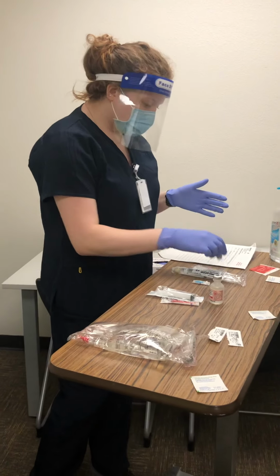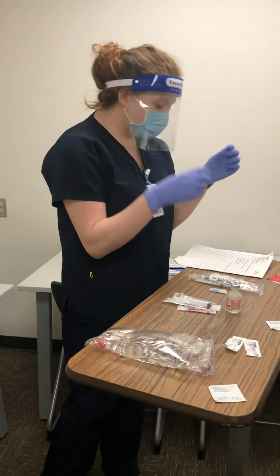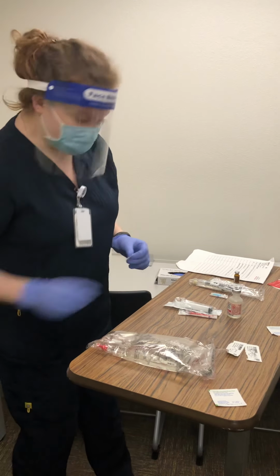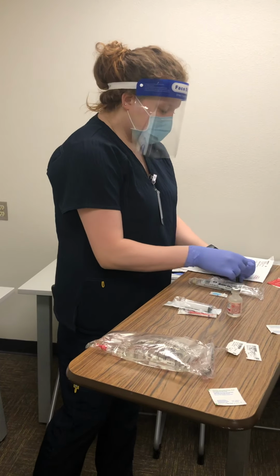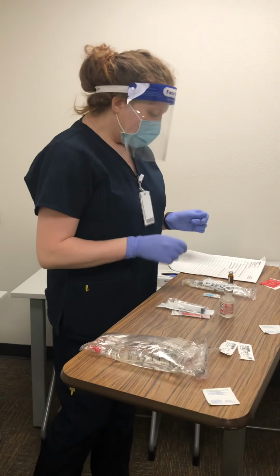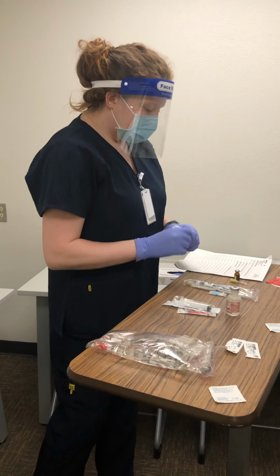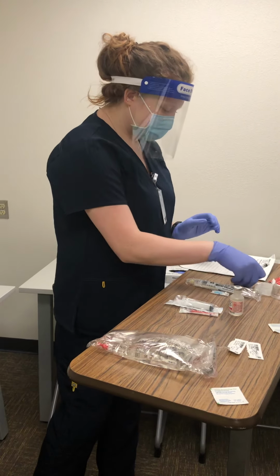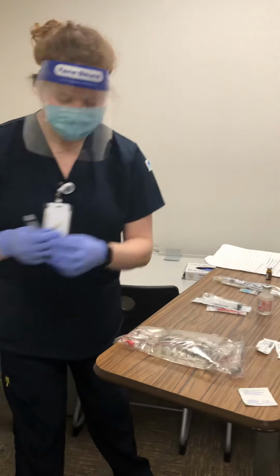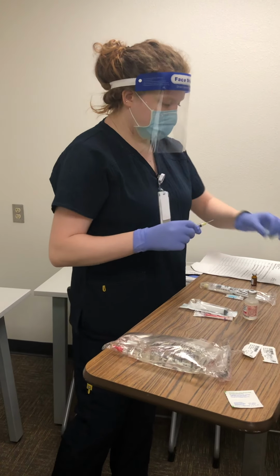So here I have my morphine bottle. I'm going to check the expiration date. I'm going to check the integrity of the bottle. That is all good. We're going to clean it. In practice, we clean it for 30 seconds, and then let it dry. For demo purposes, we're going quicker than that. Okay, so while that dries, we are going to get our needle. Okay. And our cap.